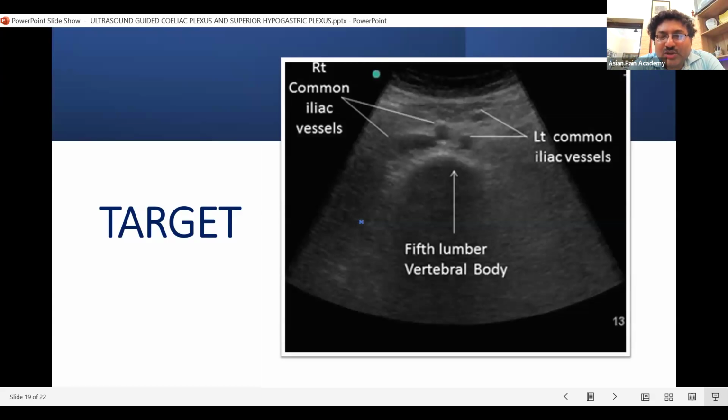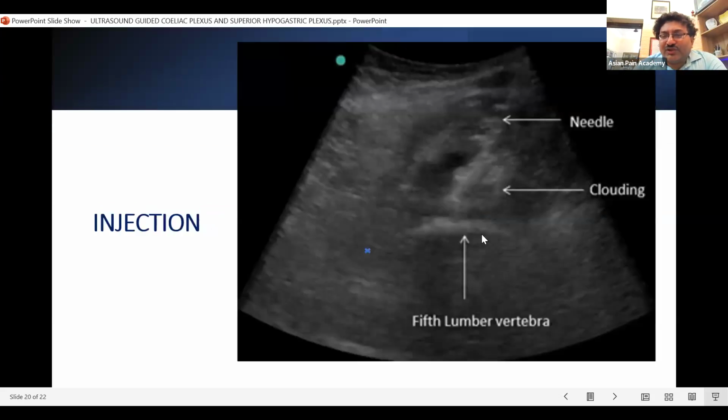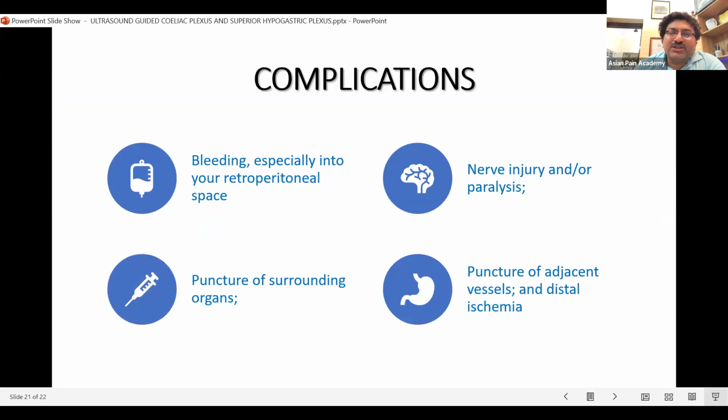Usually, the arterial bifurcation occurs first, and then the union of the left and right common iliac veins occurs. The left common iliac vein crosses over the upper part of the L5 vertebral body to reach the right side to form the IVC. So you have to come slightly down to the frog sign. When you can see the frog sign without any vessel in between, we put the needle just anterior to the fifth lumbar vertebra. Then you inject around 10 to 20 ml of the neurolytic, and then take the needle out. That is the procedure.